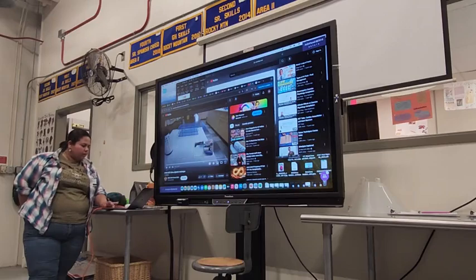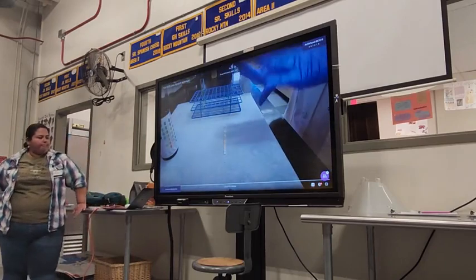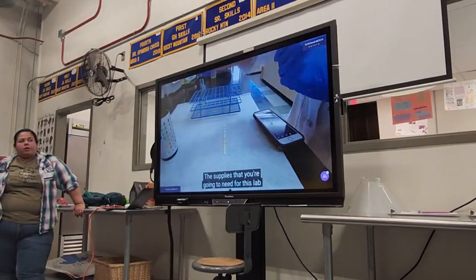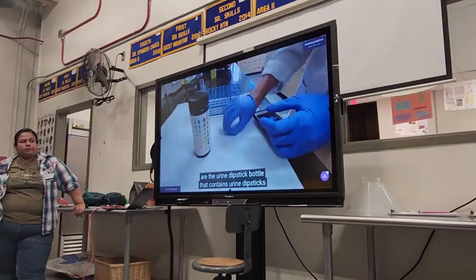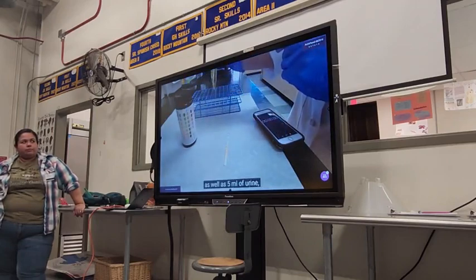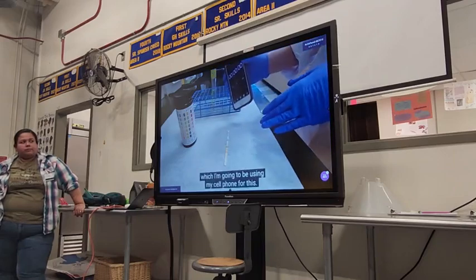This video is going to demonstrate the urine dipstick examination. The supplies that you're going to need for this lab are the urine dipstick bottle that contains urine dipsticks, the color wheel for each of the dipstick pads, as well as 5 mLs of urine, and a stopwatch, which I'm going to be using my cell phone for this.